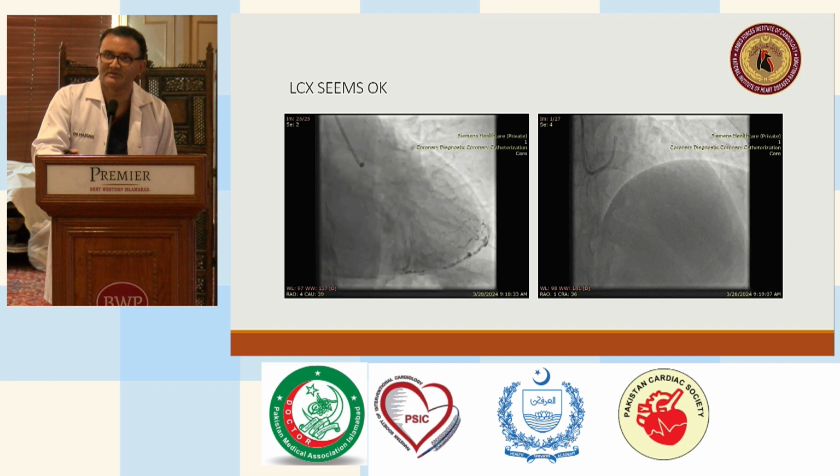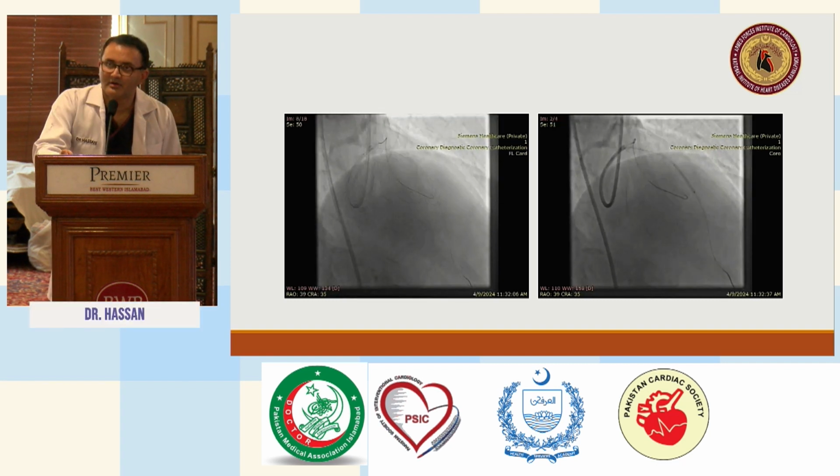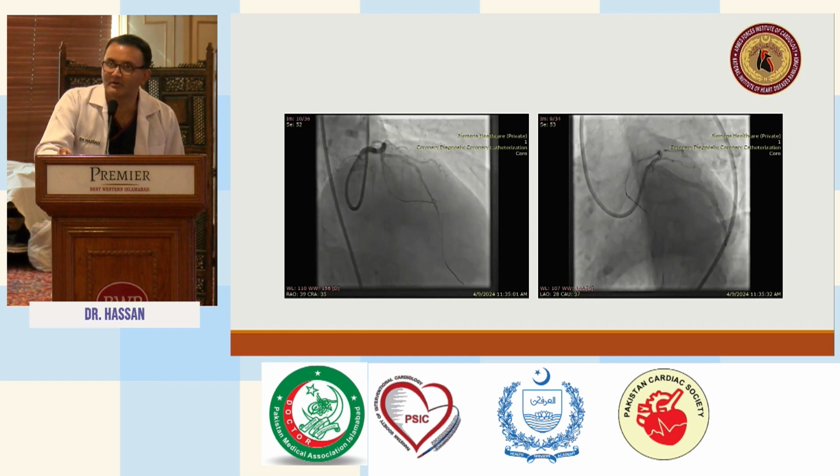Here we can see the left side seems pretty normal. There is some disease in the distal course, otherwise okay. So here is the picture after the ballooning. It's a good size vessel.